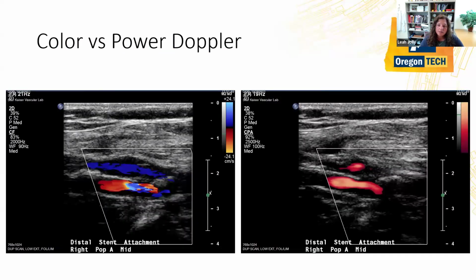So this is just a stenosis comparing color Doppler and Power Doppler, and you can see this narrowing on the color Doppler. You can see nice red color here, and then we get to the narrowed segment. And yes, lo and behold, color aliasing. So that rainbow color mosaic right here. And then we get beyond that area and we can see some red and some blue, and that's suggesting that there is some turbulent flow right there.